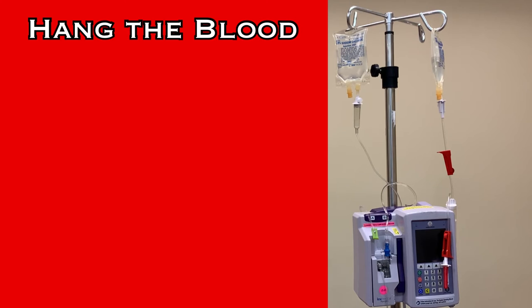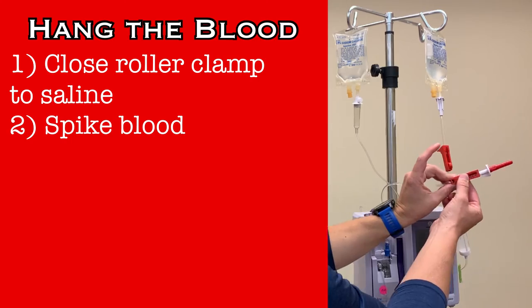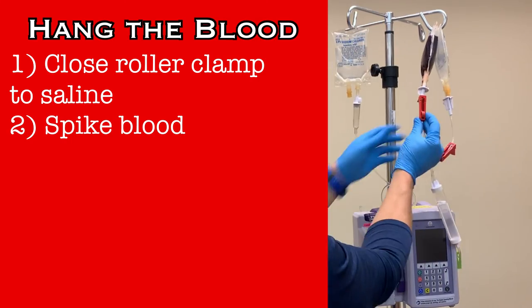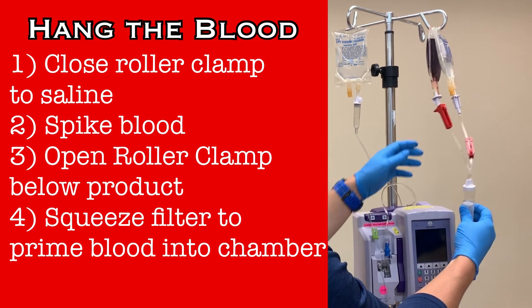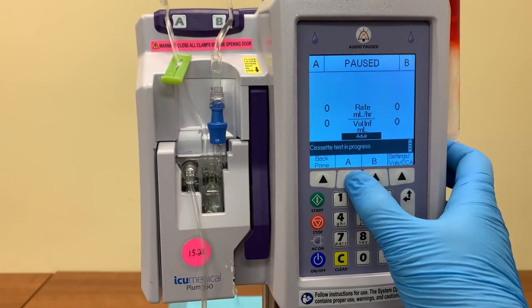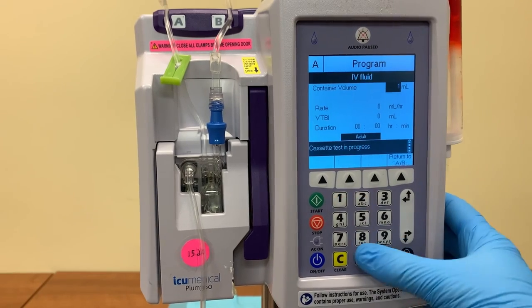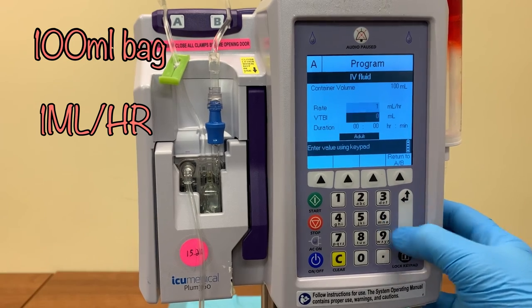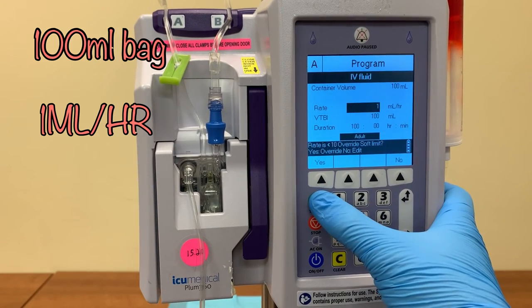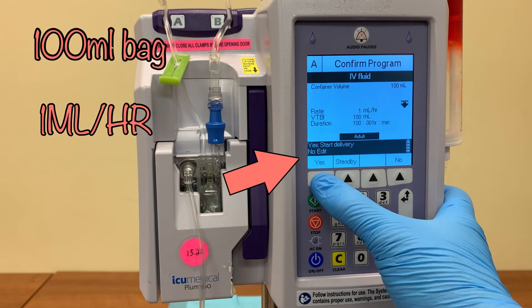Now hang the blood. Close the roller clamp leading to the saline and use the remaining spike to access the blood product. Open the roller clamp below the product bag and squeeze the filter chamber to prime some product into the chamber. Program the infusion pump using the drug library. The priming line should be programmed with IV fluids to the volume of the normal saline bag that is hanging, and set the rate on this to only 1 milliliter per hour, which will require you to verify an override for a soft program lock.